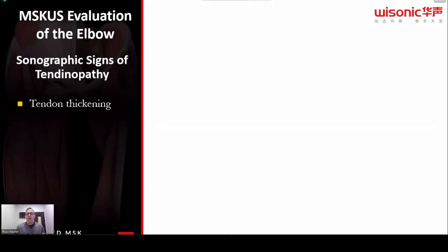So here's some typical things that you see with tendinopathy. Now this does not just mean in the elbow. This means tendinopathy in the body. So save this slide for later, right? So you're going to see tendon thickening, overuse. It gets thicker and thicker over time. You get those small intrasubstance tears, not these big clefts, not these big holes that comprise massive ruptures. No, small interdispersed tears and holes throughout.